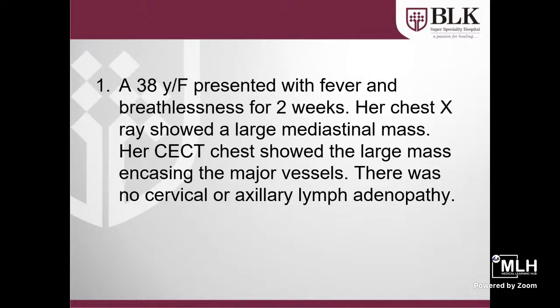So this is the first case, where a 38-year-old female presented with fever and breathlessness for 2 weeks. Her chest x-ray showed a large mediastinal mass. That means there was a large mass in her chest. Her CT scan of the chest showed a large mass encasing the major blood vessels. There was no cervical or axillary lymphadenopathy. That means there was no lymph node which could be easily accessed by a surgeon.